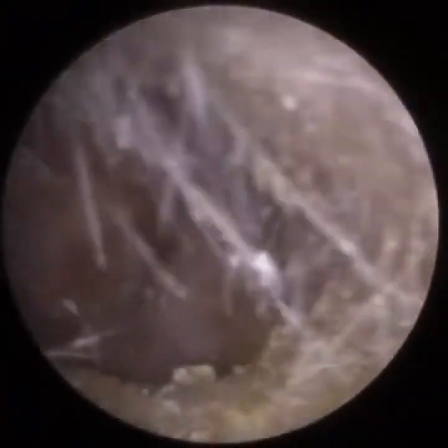And whilst we're doing this, we're going to make sure we don't cut into the ear canal. By cutting into the ear canal, if we abrade it, the patient's likely to develop a secondary infection, because the mid part of the canal, the deeper part of the ear canal, is exposed. So this skin acts like a protective layer. We don't want to get through the fresh layer of skin that's not yet dead and is still lining the ear canal. If we cut this or abrade it, it'll allow bacteria to enter deep into the ear canal, causing a secondary infection.